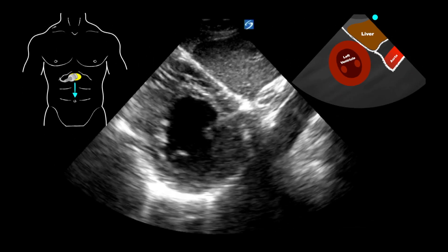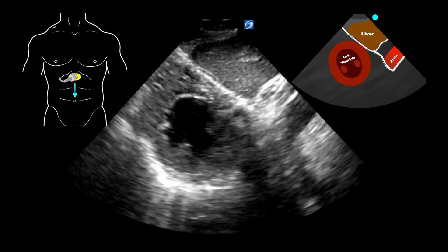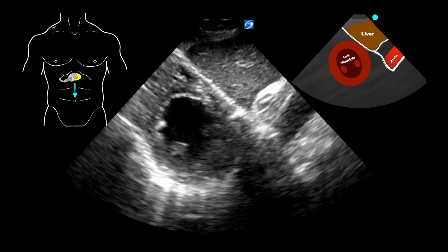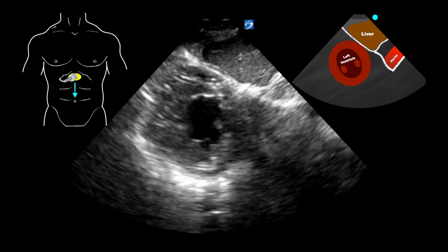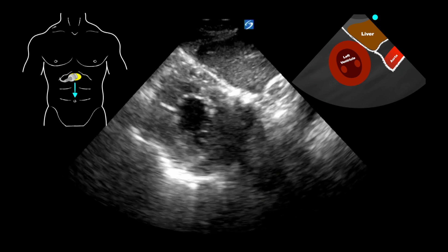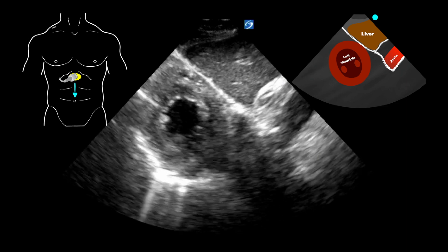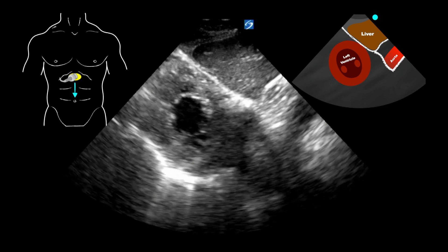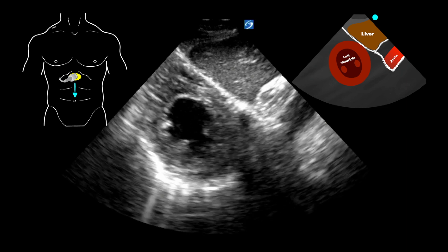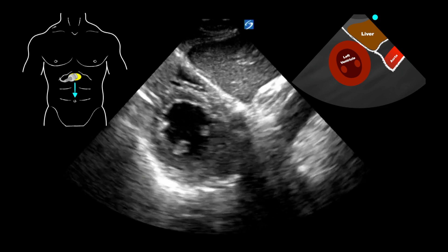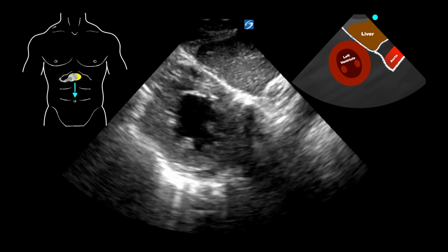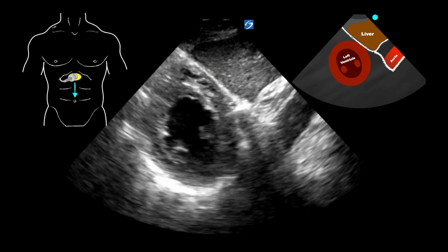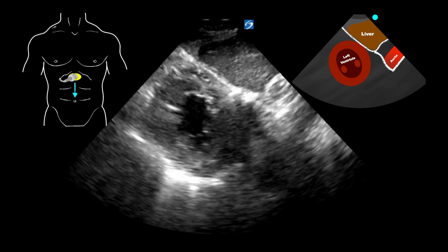Let's look at a live example. Here we have a subxiphoid short axis view. We can see the liver at the top of the screen and the left ventricle just inferior to that. We can see that the contractility is really good and very concentric — there are no wall motion abnormalities. We can also evaluate that there's no free fluid around the heart in this view.